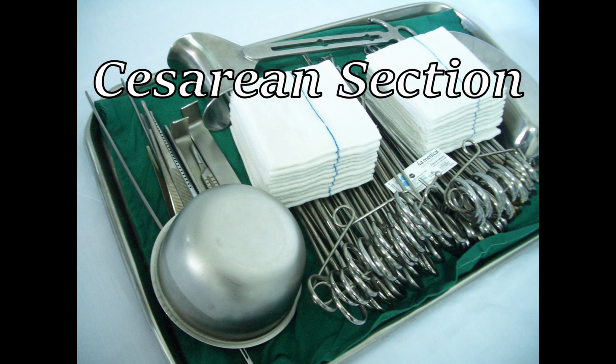A low transverse incision is made in the lower uterine segment using a scalpel, then extended bluntly with fingers or bandage scissors. Pitfall. Avoid extending too far laterally where the uterine arteries run. Uncontrolled extension risks hemorrhage or broad ligament injury. Pearl. If the lower uterine segment is poorly developed, e.g. preterm, a classical vertical incision may be required instead.